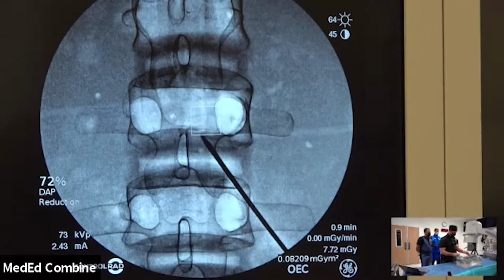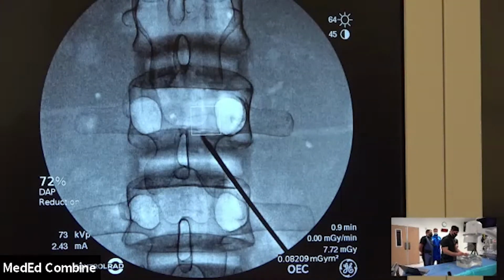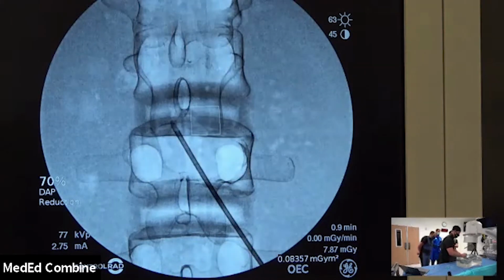So now I just need to get just a little further into this space. Let's see if I can get that to drive. So it had a nice loss. Those of you who are here, you can see the air actually go in. Is it going in? It's still not going in. Take a shot, see where it is. Maybe I just got a little off there. Let's angle just a little bit back.